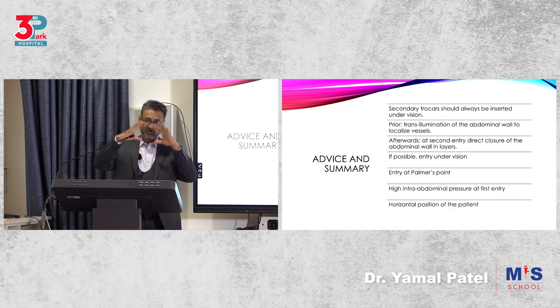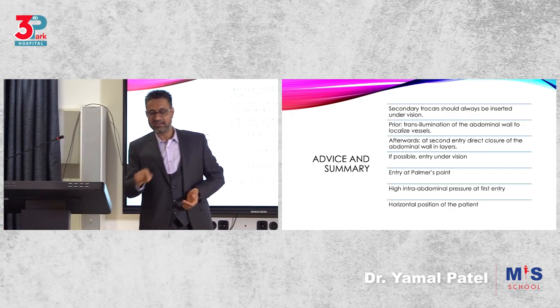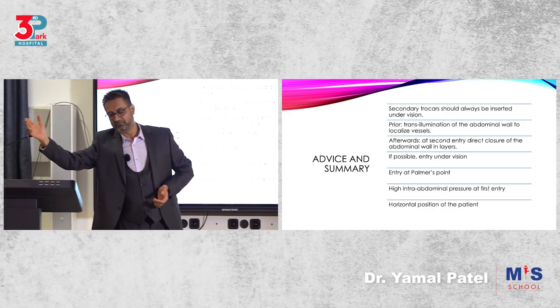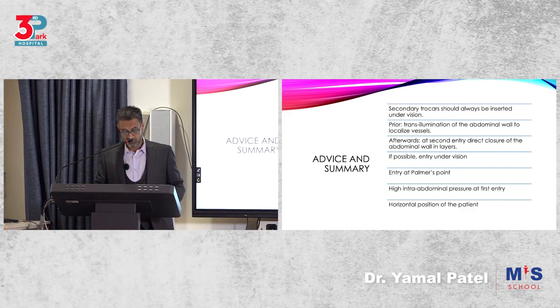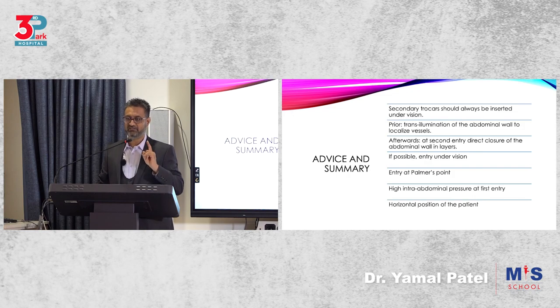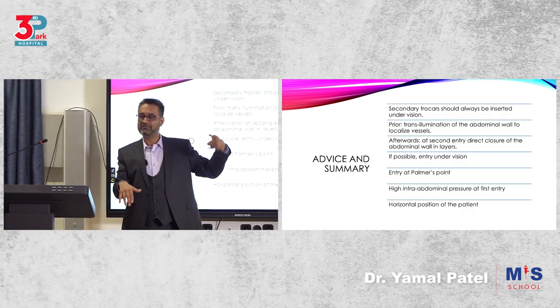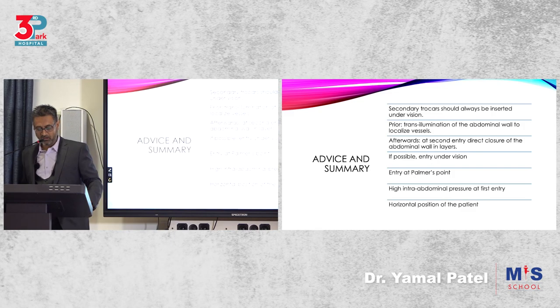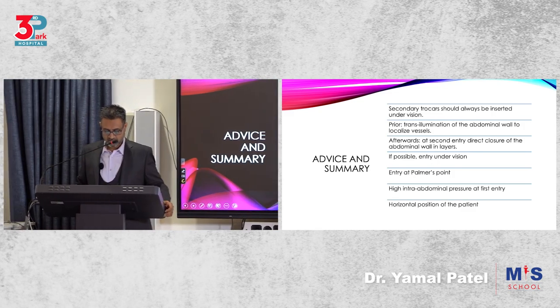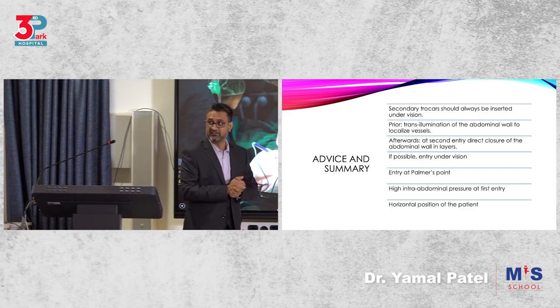Entry at Palmer's point. You should know your entry points: the umbilical, intra, supra, infra, Lee Huang's position, Palmer's position, Jain's position. These positions should be known to us. And this should all be done with the horizontal position of the patient, as I've said. Don't give a head low before your ports are in, okay? For the secondary ports, yes, you can give a head low so that the bowel has moved away when you put the secondary ports. But the primary port is always in a horizontal position. Be careful, this one will be in those difficult entry cases.